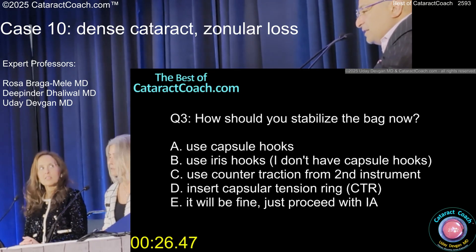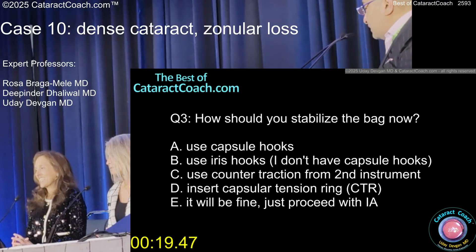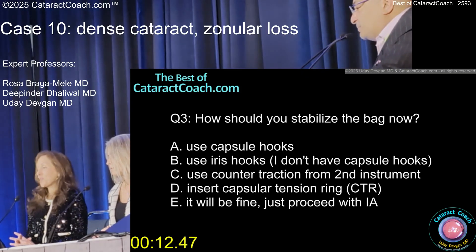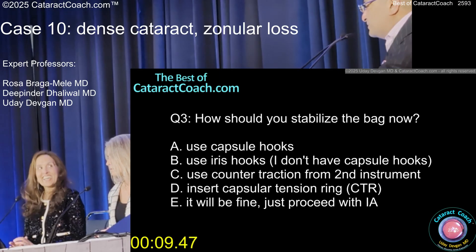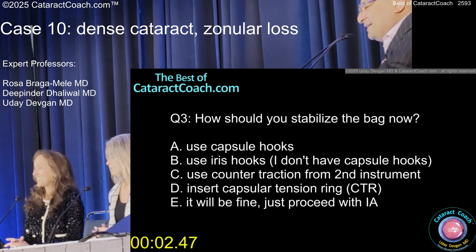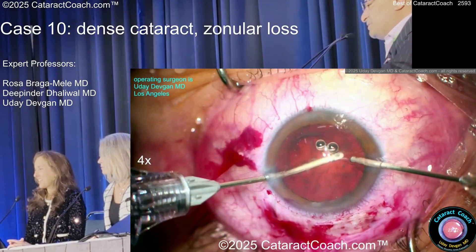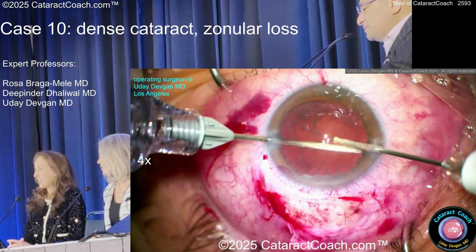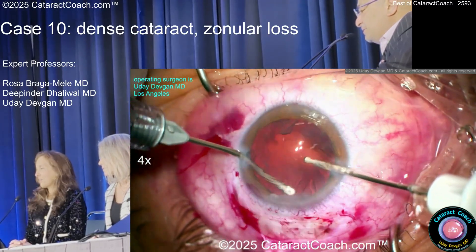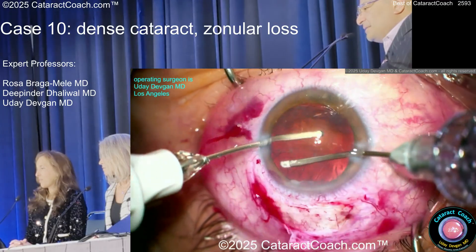Do you think stabilizing with a CTR alone will work, or will I need a sutured segment? Let's see how it looks. In this case, if there is a problem you can really blame the patient — it was trauma, a sucker punch, left eye, right hook, 10 years ago. Patient wanted to make sure it wasn't going to go away on its own. Zonules never forget. I'm going to proceed with irrigation/aspiration — there is cortex, so just do gentle tangential sweeps, by manual technique.